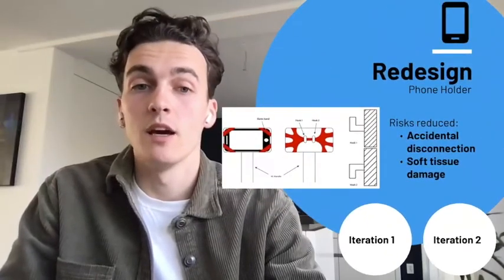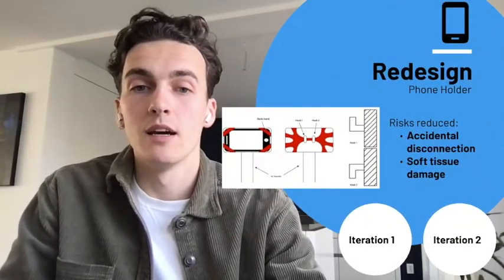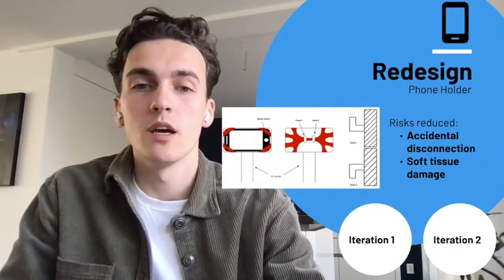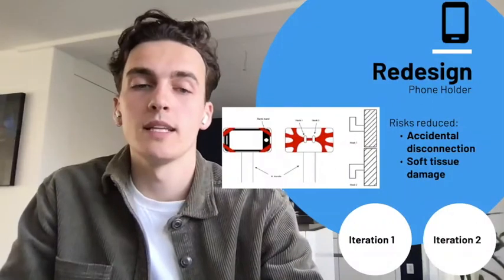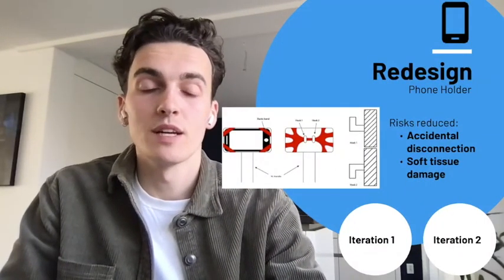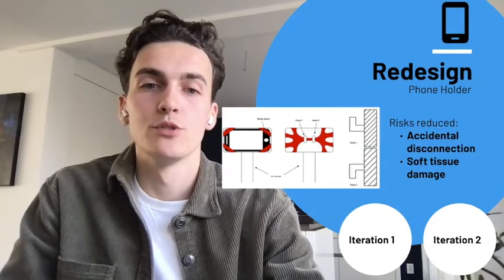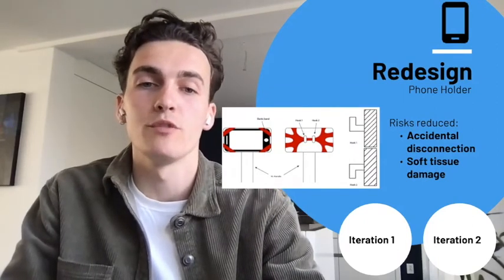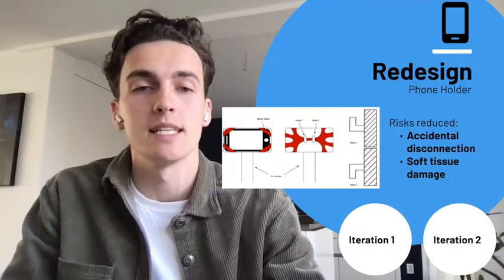The last iteration, which was the final design, improved the cleanability by decreasing the number of parts to 2 parts and subsequently decreasing the amount of moving parts, ridges, and nudges. Nevertheless, the elastic band may introduce disinfecting and sterilization problems, which need to be further evaluated before finalizing the design.